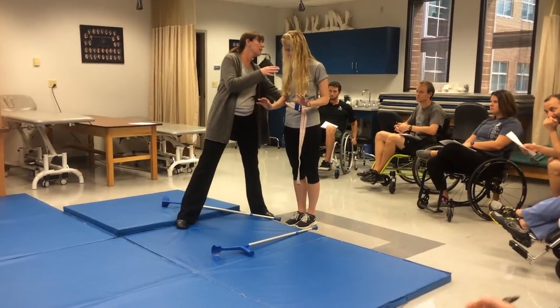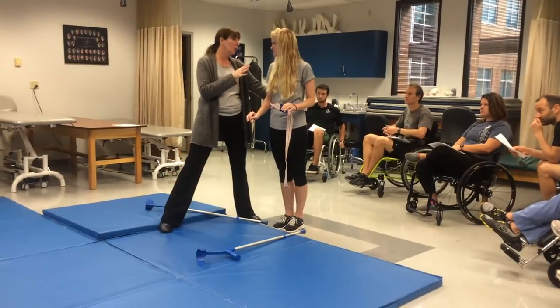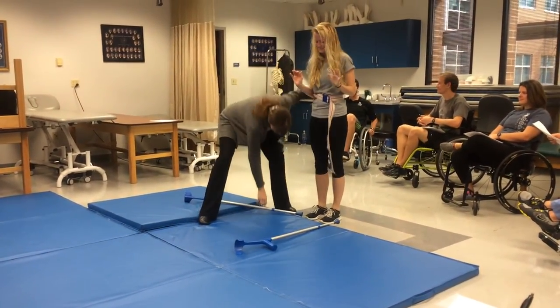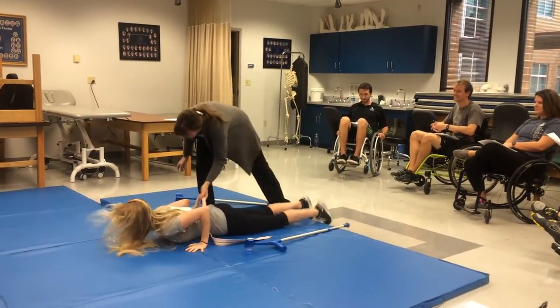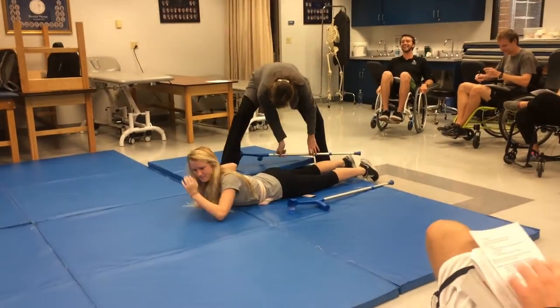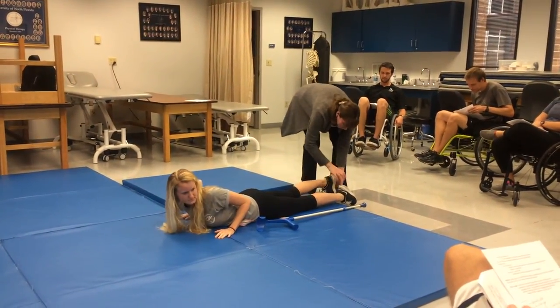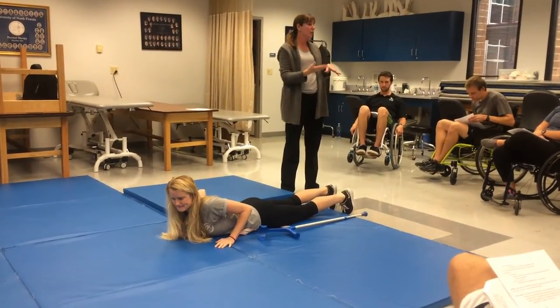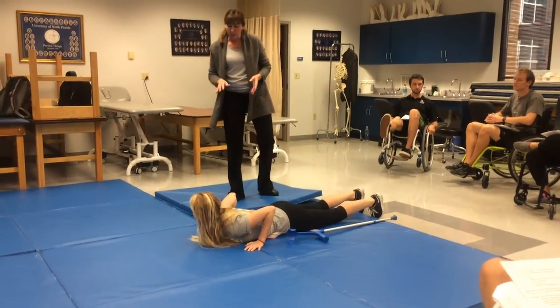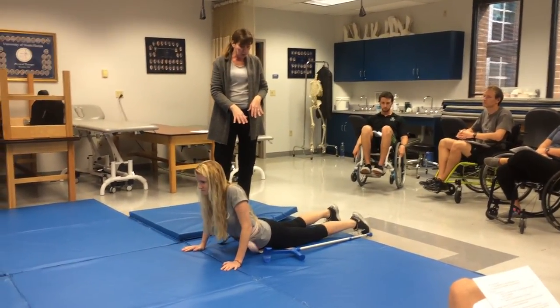Lower them down to the ground with knees straight, going straight down on those arms. Once the patient is on the floor, they gather their crutches lined up by their hips. Their feet will be in a position because they're in KAFOs — you want to use that passive dorsiflexion range of motion. The goal is to come up on the arms — almost like a plank position — with legs straight, using toes underneath for support.